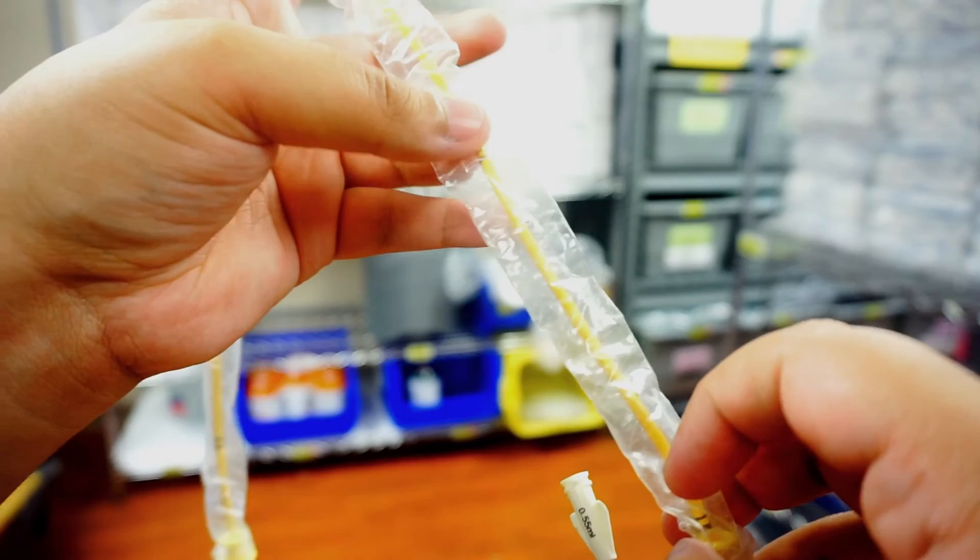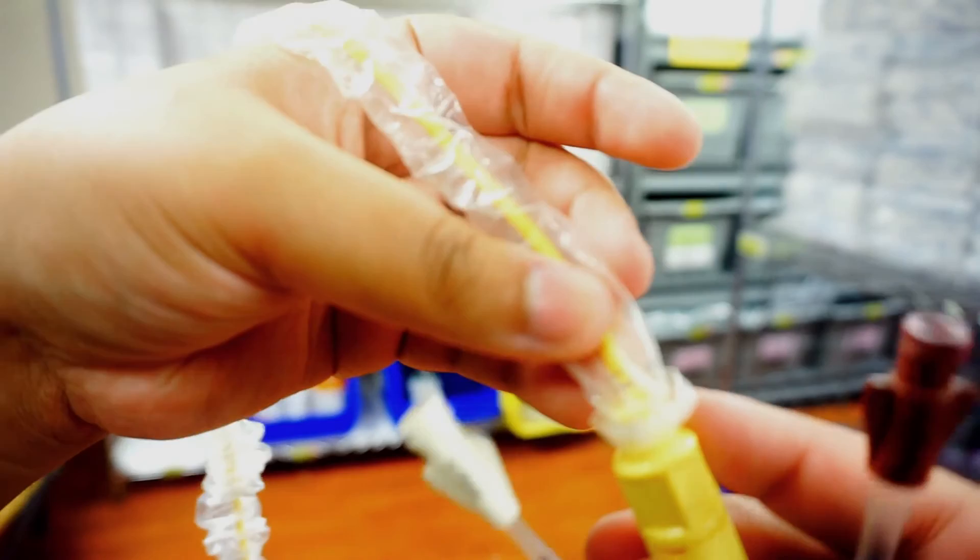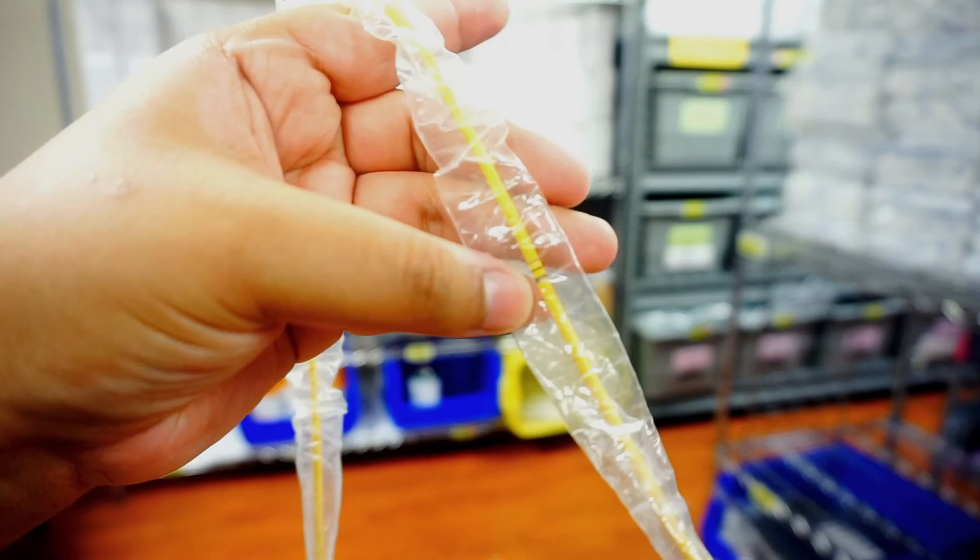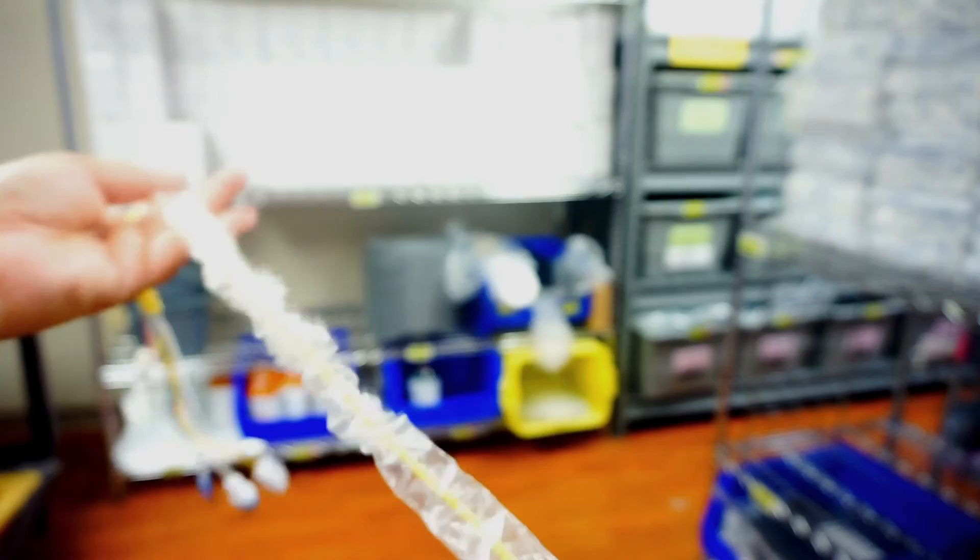So here I have it pretty close to the 60. So this one would be in the internal length of the Swan, it would be 60 centimeters. So again, you have your markings, thick mark is 50 centimeters, thin marks are 10. So this is 70. You always want to make sure to hand off what the internal length of the Swan is.